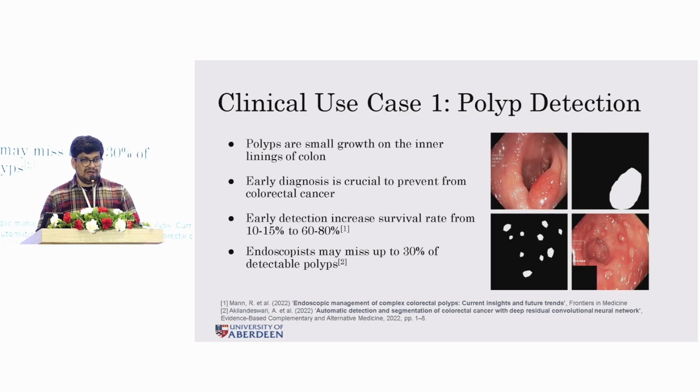Moving on, I will take some representative clinical use cases and show how we apply federated learning in our lab. One of them is polyp detection. Whoever has a clinical background must know it very well.